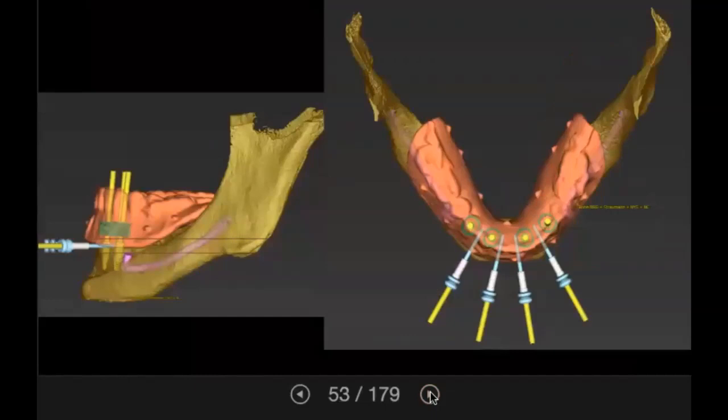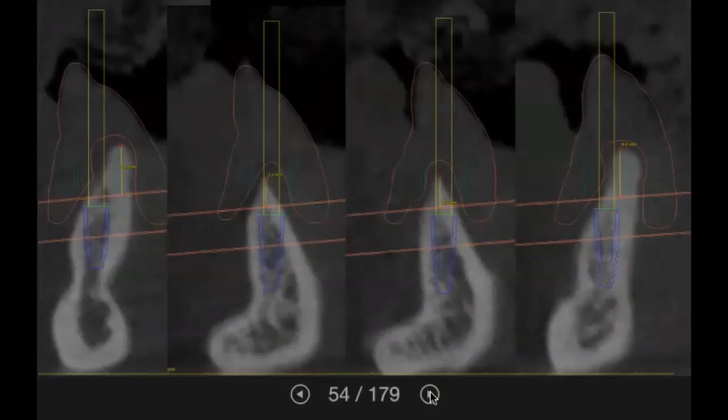4 skeletal fixation pins are designed to hold the guide in place during his implant surgery. Between 4 and 7 millimeters of vertical bone reduction will be required to place the implants in solid bone and at a similar platform level.